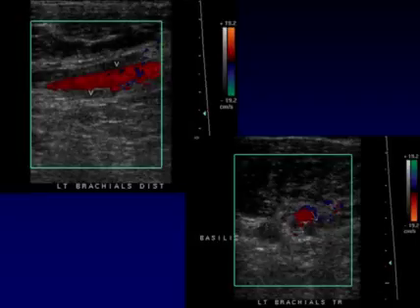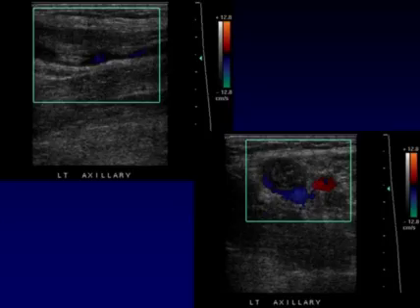This transverse image of the same patient shows you the two brachial veins applied very closely to the artery, and the basilic vein, which is, again, larger and more superficial and not paired to an artery. Therefore, it is a superficial vessel, even though in this particular case it may harbor more clot and be larger than the accompanying brachial arteries.